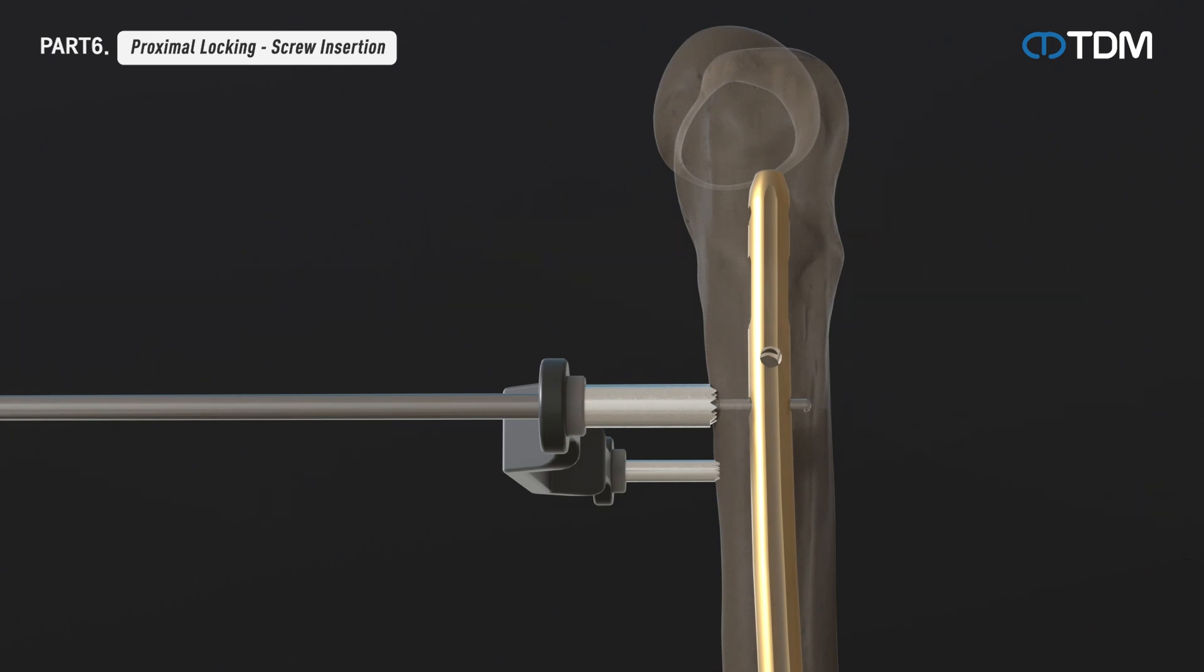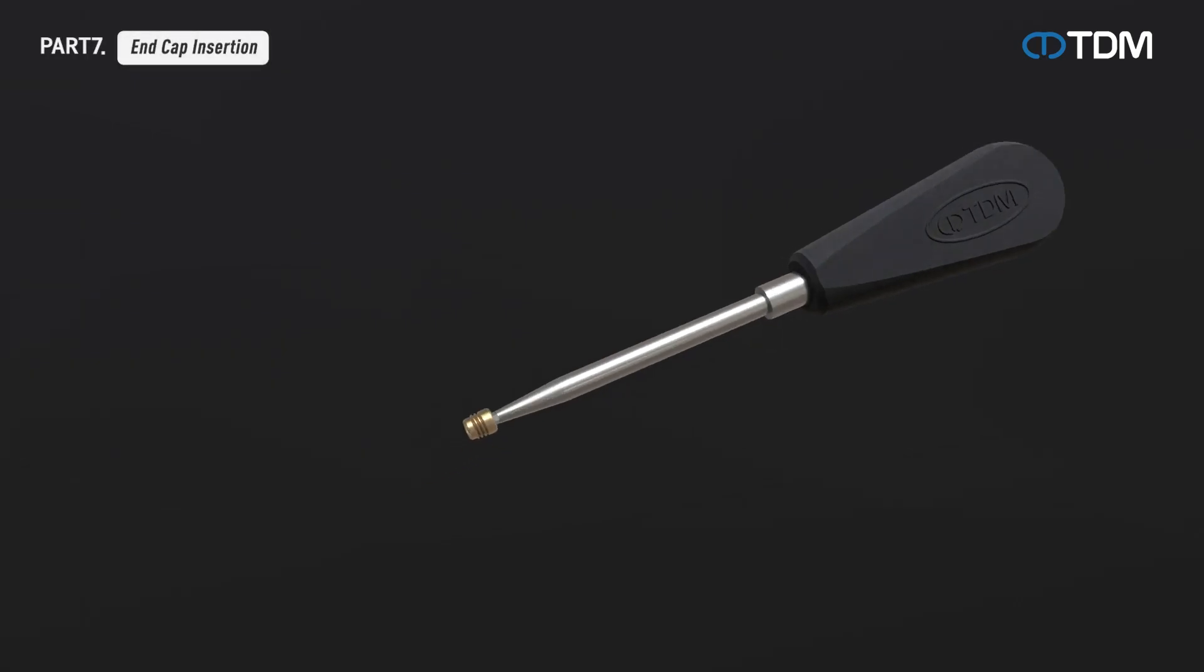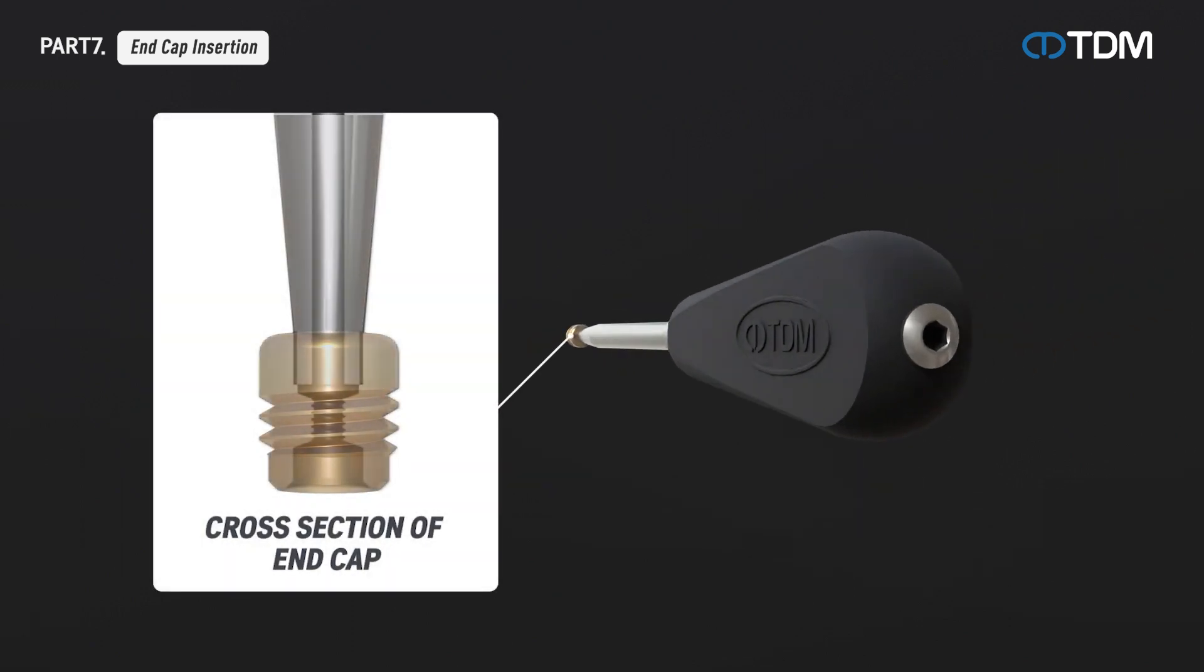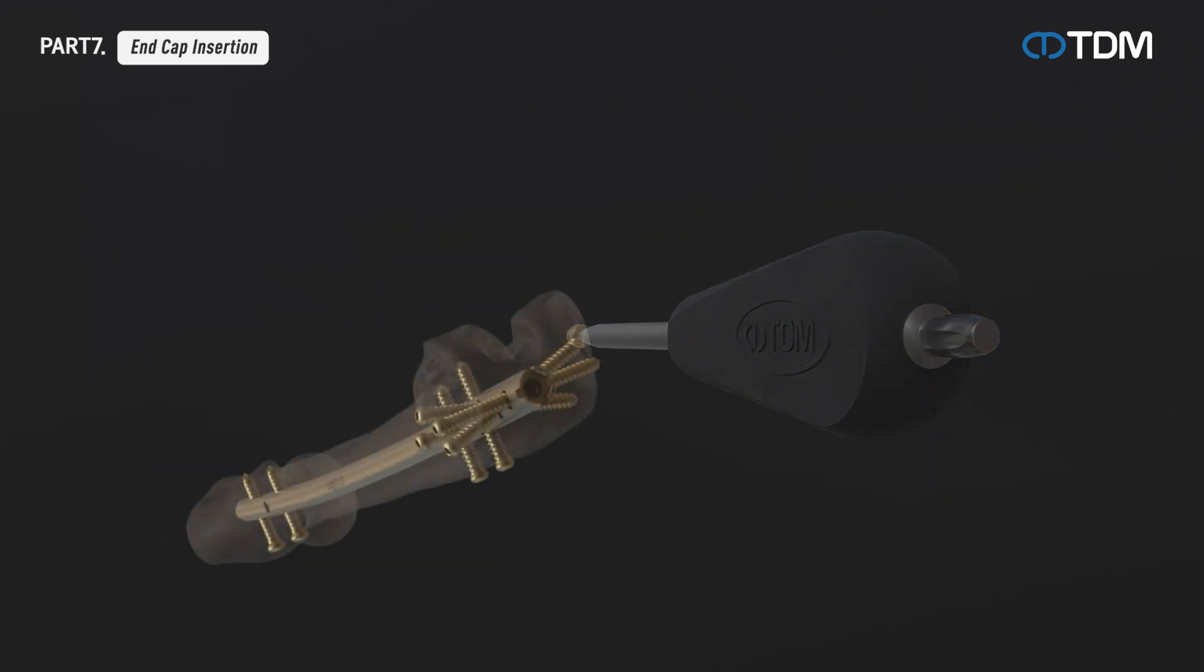Attach the selected end cap to the end cap driver and rotate the coupling screw inserted into the driver to fasten the end cap to the driver. Insert the fixed end cap into the top of the nail to tighten. When the end cap is secured on the nail, release the coupling screw and remove it from the driver to complete the procedure.